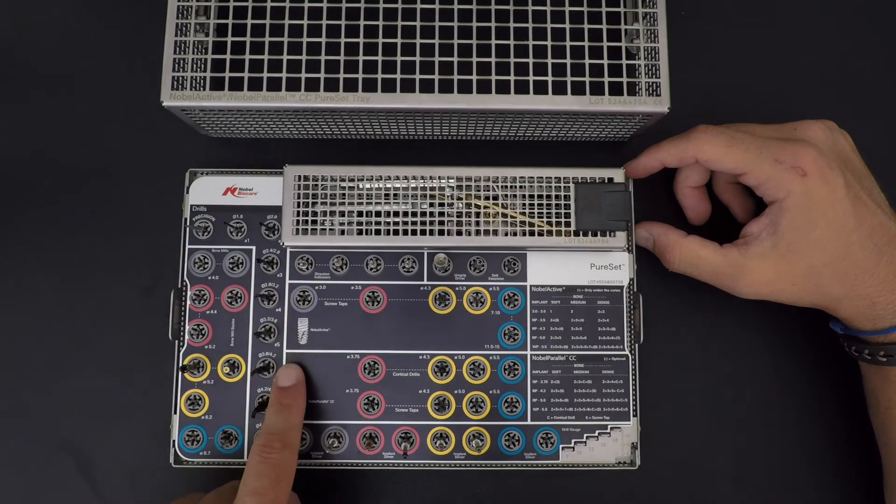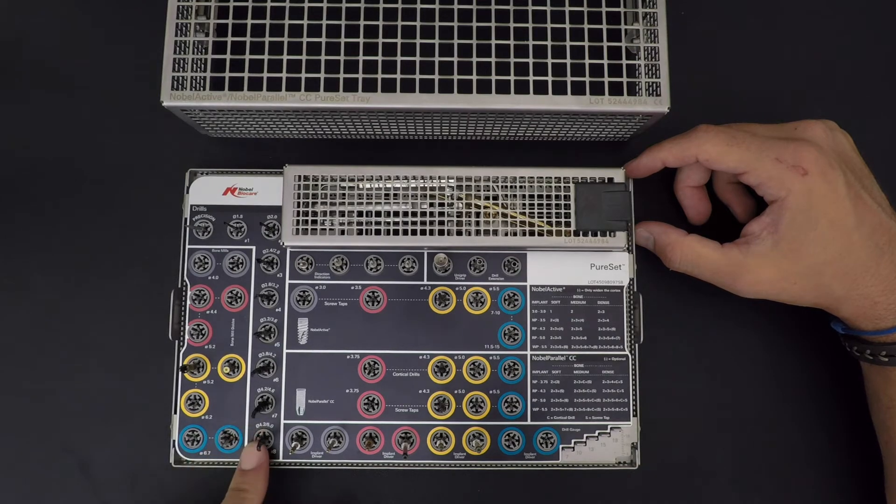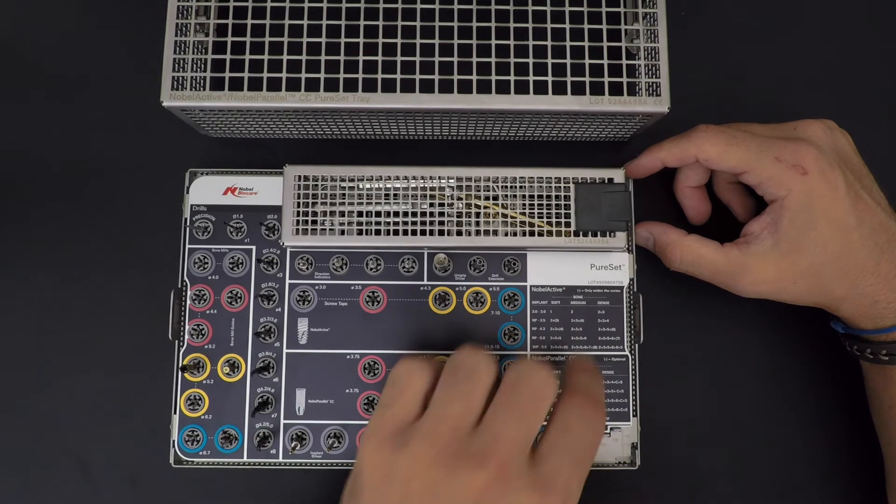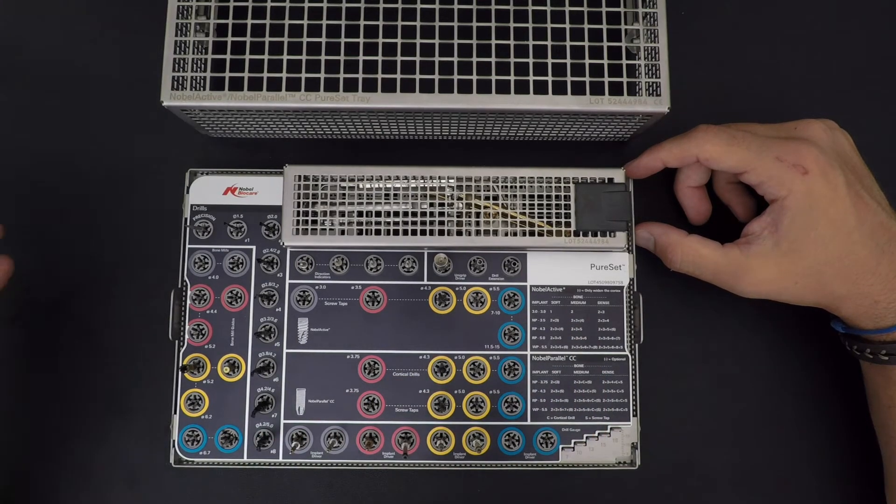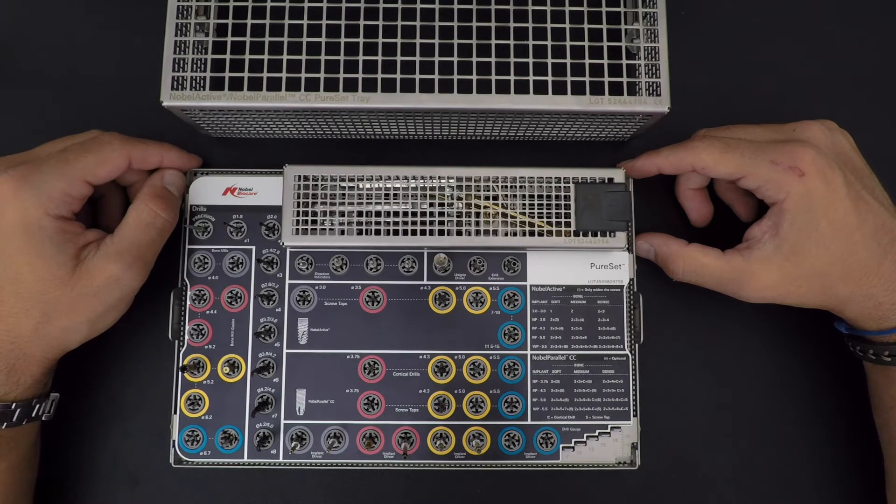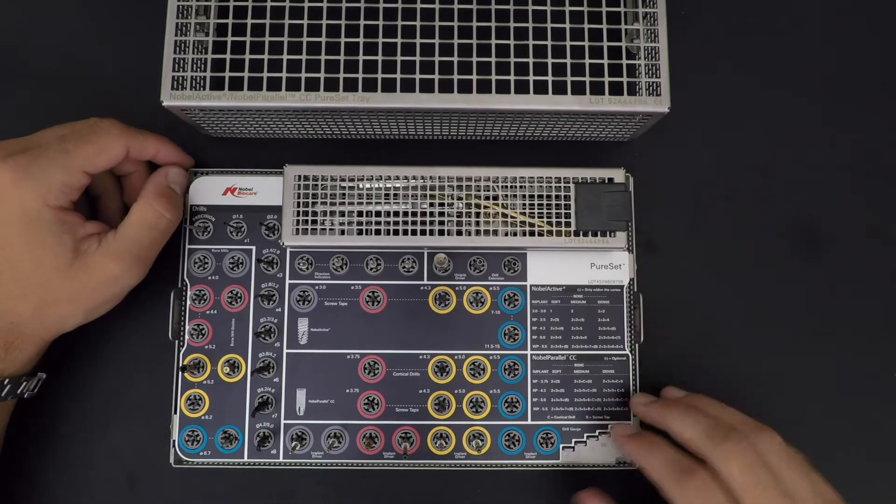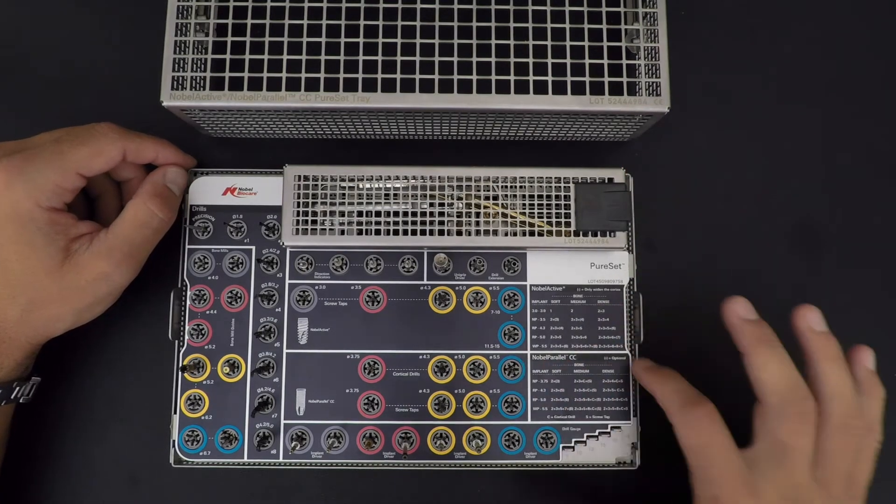We're going to take an example which is the one we use most of the time: it's Noble Parallel CC, which is at the bottom. Noble Active is at the top.